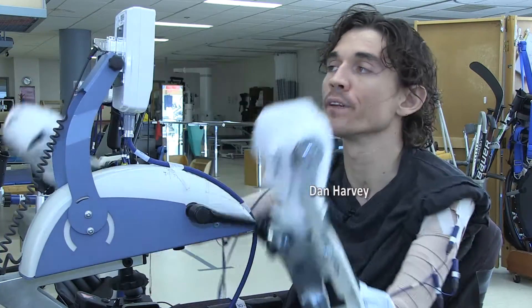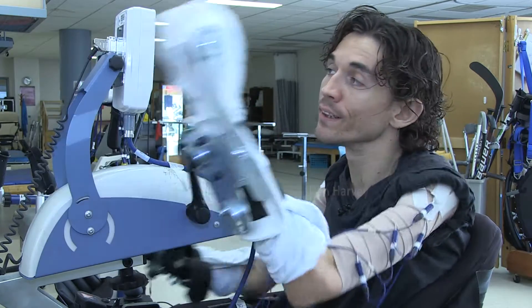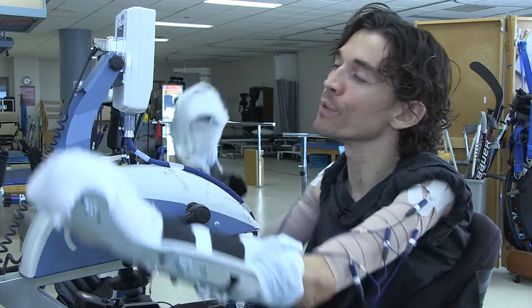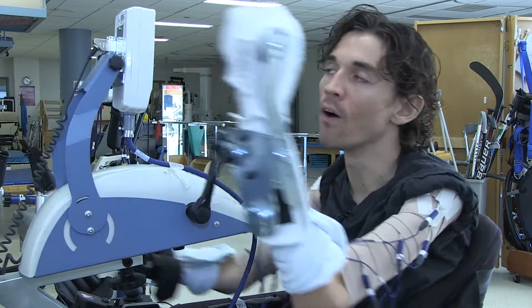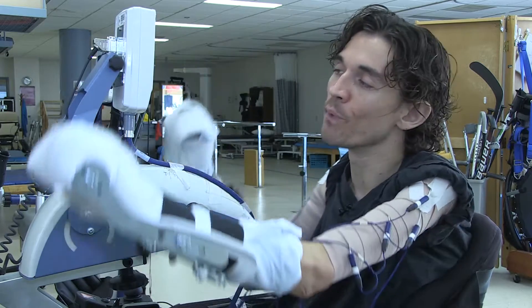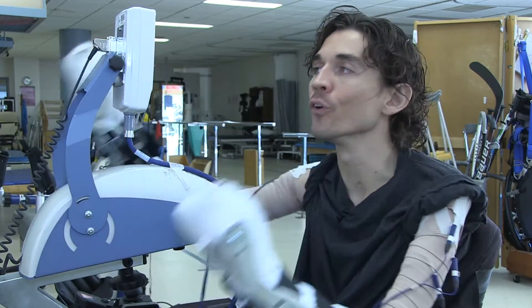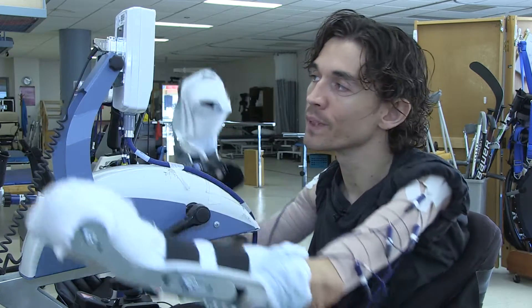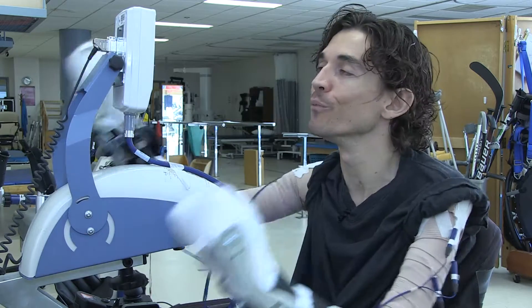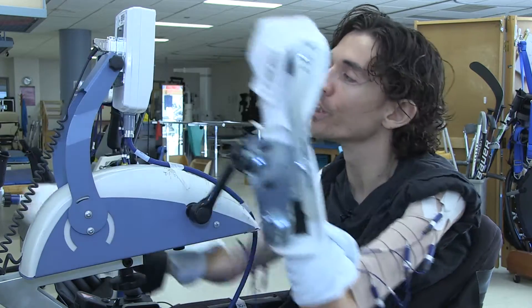I've been using the bike for the past three or four months and I've noticed quite a bit of a difference. Some people might look at it as a small achievement, but even small things like being able to reach a certain button in my van or being able to reach my thermostat a little bit easier — to me that's a pretty huge difference.